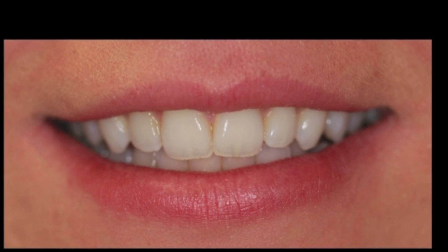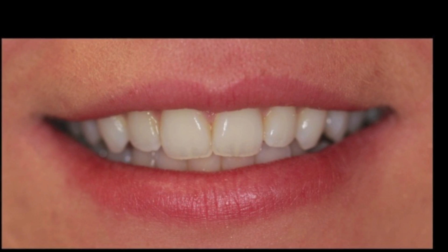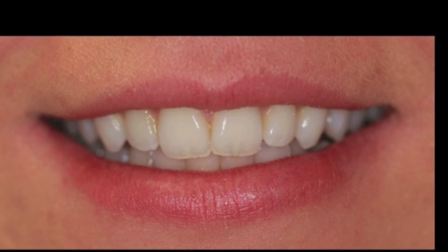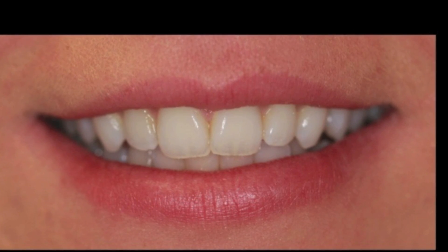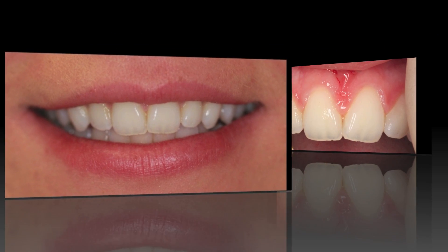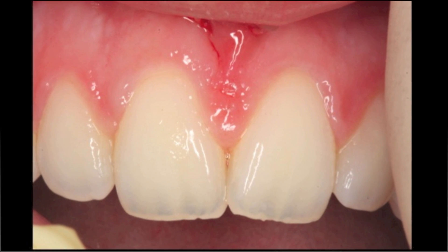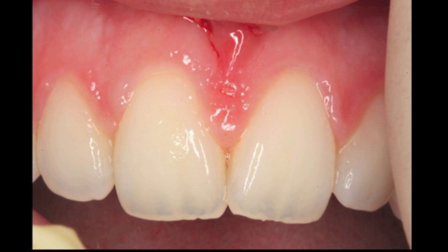The smile line is quite pleasing but we do have to be careful in this case. If we look at the retractive view a little closer, we can see that this tooth has some interesting coloring, some halo effects, and some type of transitional mamelons.